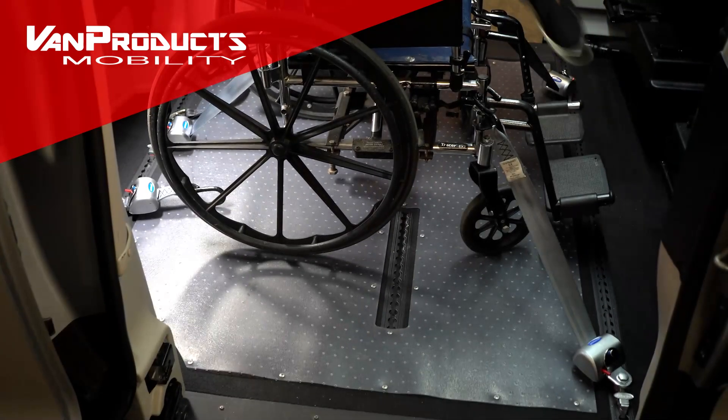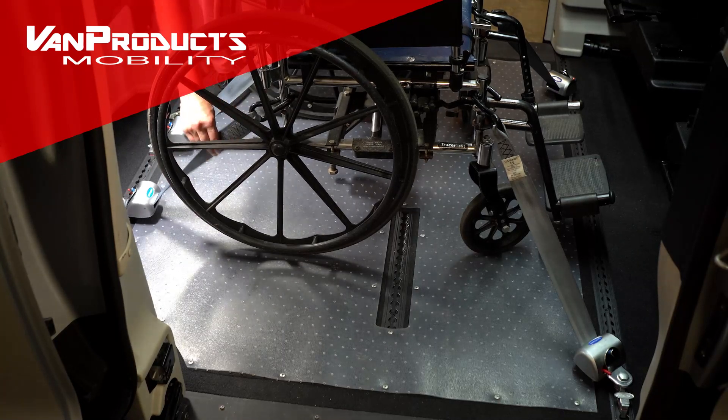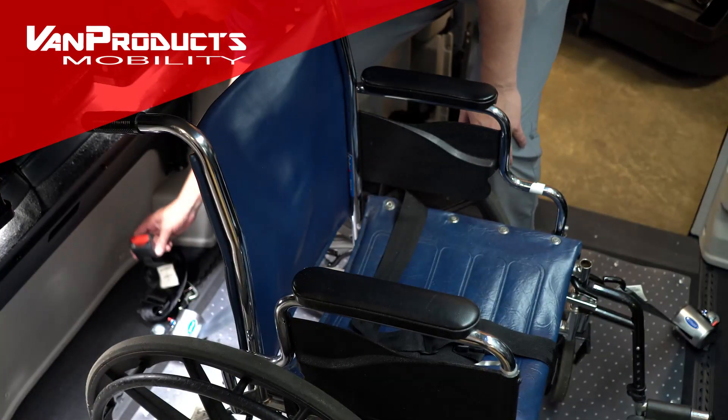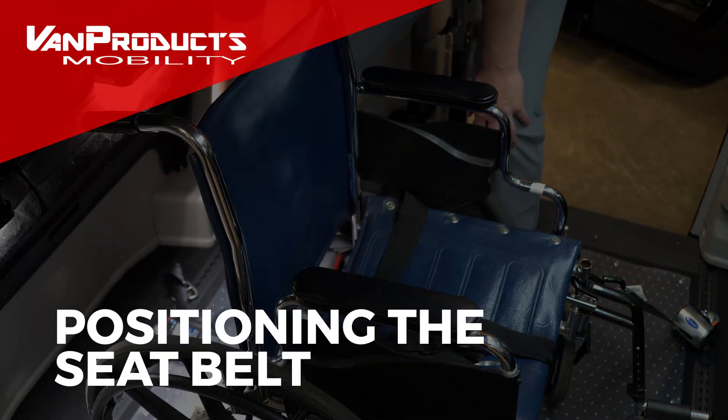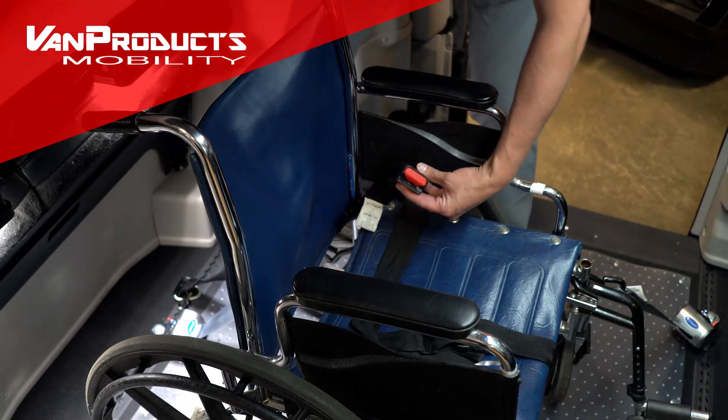When securing the wheelchair, make sure that you put the hook in the proper location — you want it on the wheelchair frame as close to the seat as possible. Once you've secured all four corners of the chair, it's time to position the seat belt.